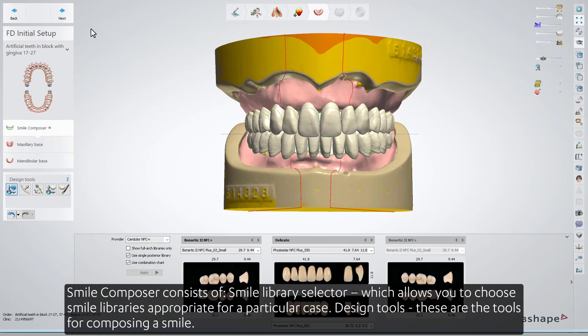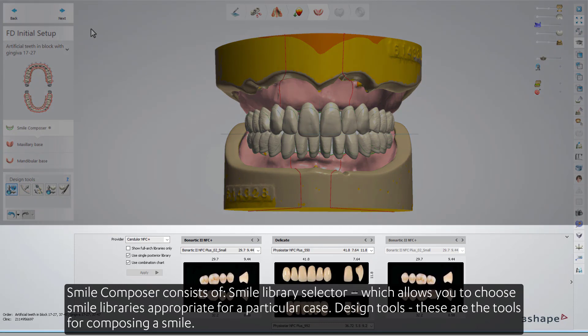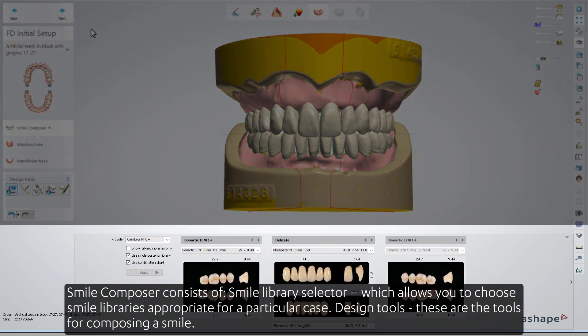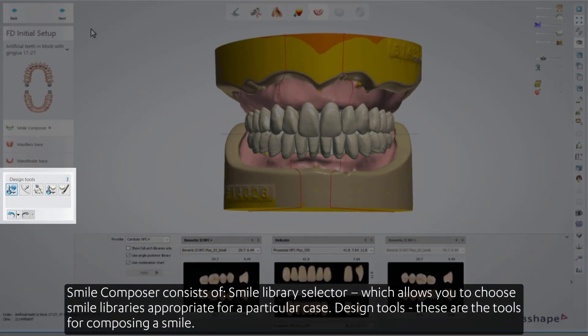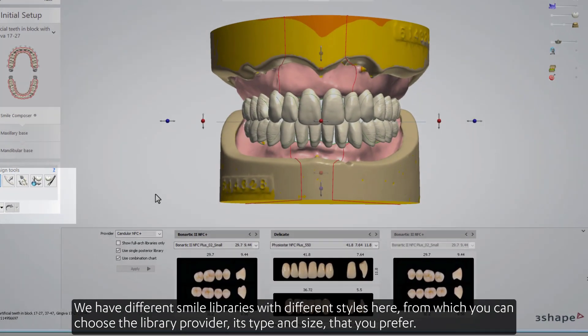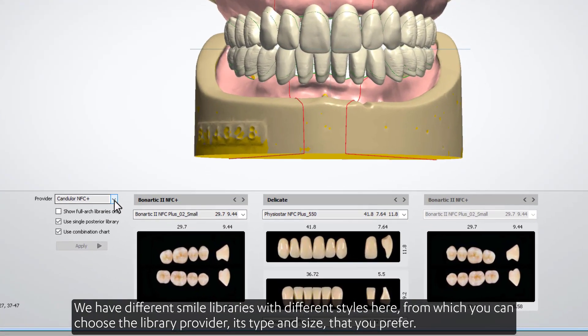Smile Composer consists of the Smile Library Selector, which allows you to choose smile libraries appropriate for a particular case, and Design Tools, which are the tools for composing a smile. We have different smile libraries with different styles, from which you can choose the library provider, its type and size that you prefer.